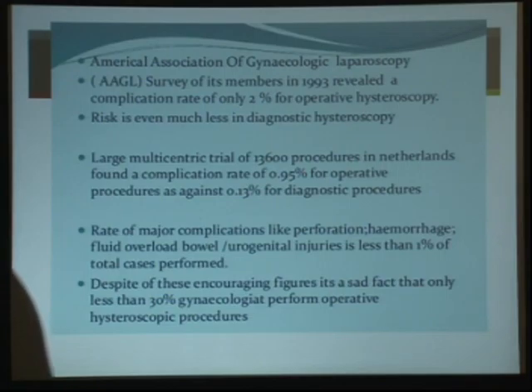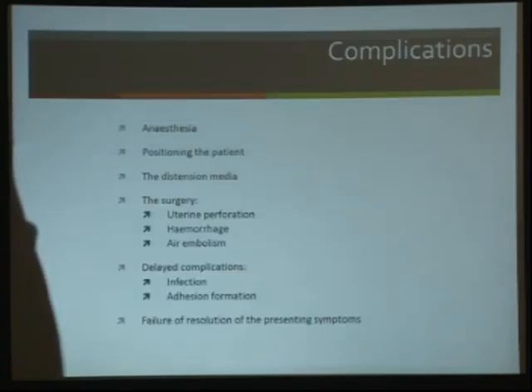Despite these encouraging figures, it is sad that less than 30% of gynecologists are doing operative hysteroscopic procedures. So we should know the complications so that we can detect and manage them at that particular time. It's important to know the complications when we are doing any procedure.